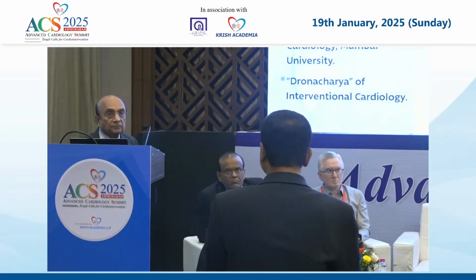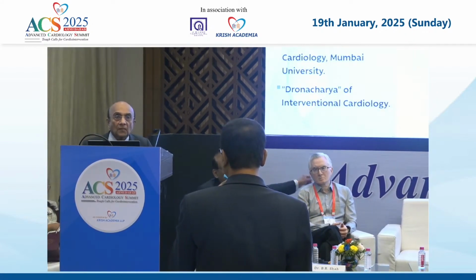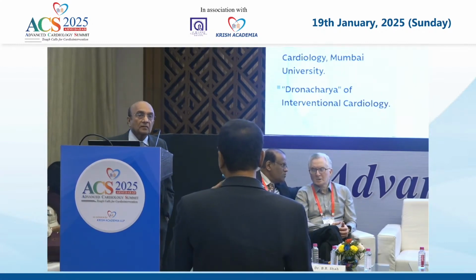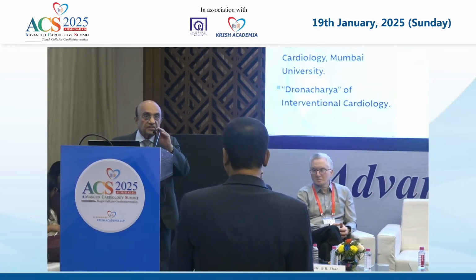Thanks for the excellent talk. Just regarding the DCB, what we believe is indicated in in-stent restenosis, ostial lesions or side branch lesions like that. Apart from that, what is your opinion on de novo lesions, CTO and ACS regarding the DCB? About the two things, about the CTO.